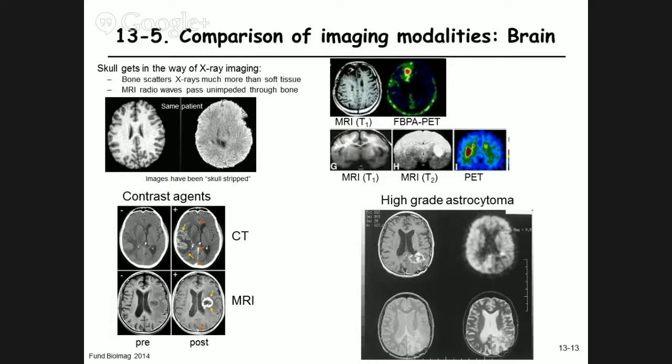Bottom left. This has good soft tissue contrast, but you don't see much fat, so it's most likely MRI. But what type of MRI? T1 or T2 weighted? T2, any takers? T1, any takers? No? Okay, good. Here are the ventricles. Same area here. Signal is bright, so that is a T2 weighted image. What about this one?